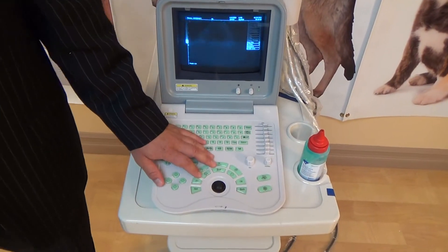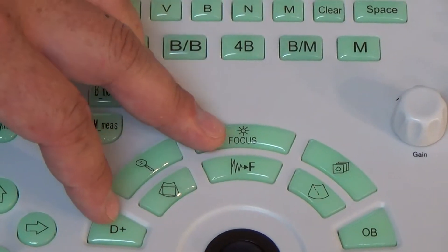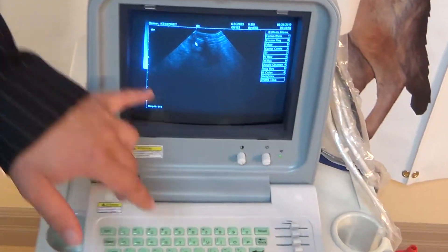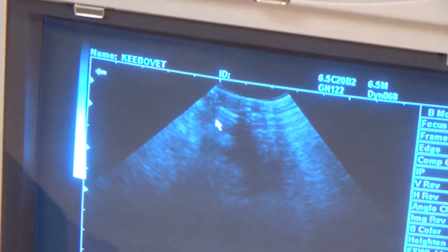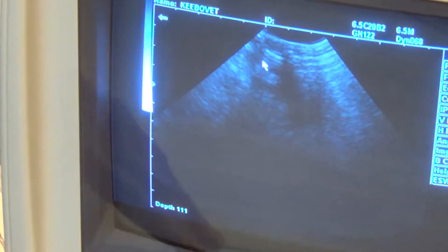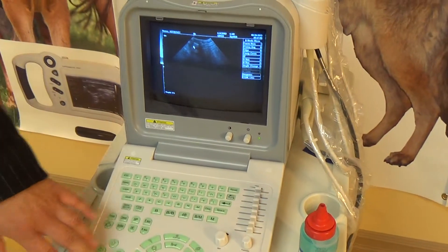We'll start off right in the center with the focus button. What the focus button does is increase or decrease the number of focus points on our screen. You can start off with one, two, three, or four — that varies depending on the type of probe you're using. Once you have several, you can't really move them, but if you only have one focus point, using the arrows off to the side of the screen, you can adjust the height of the focus itself.